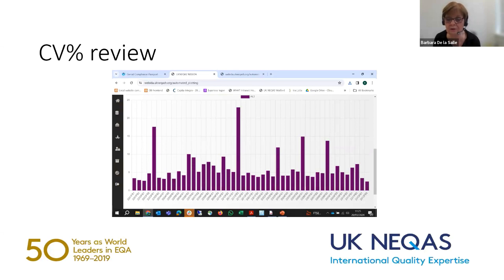Not to just get the answer that we want. It sounds a bit like fudging the factors, but you can generally eyeball the data. And Yvonne and I do almost every single survey that goes out. I always dread the point when she says, can you just look at this data with me? And I think my heart sinks. I think, oh no, I just don't want to. But we do eyeball the data, and we can spot then if there are blunders that have not been trimmed, and we do need to take those out, and we will then rerun the stats, rerun the CVs.